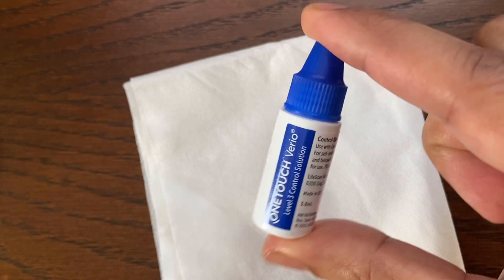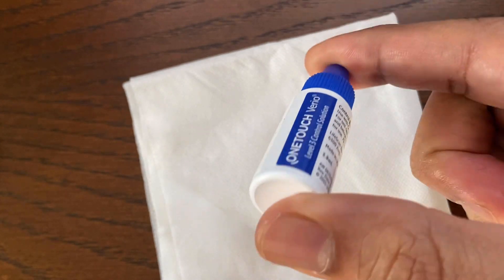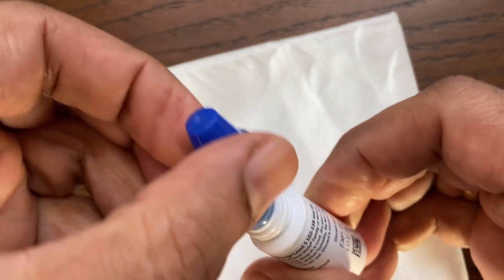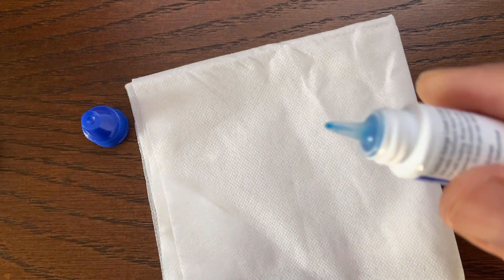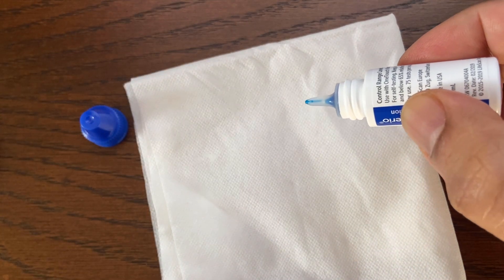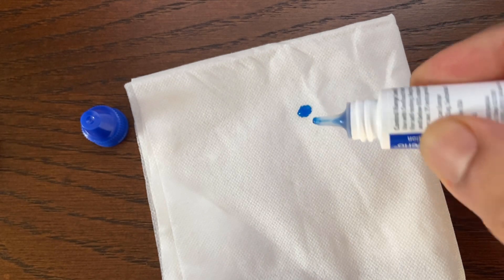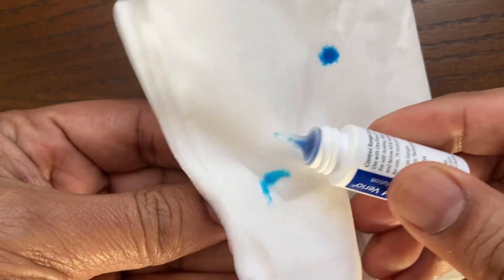Next, shake the control solution bottle gently. Also make sure to check the expiration date and instructions on the bottle to determine the discard date. Remove the cap and squeeze the bottle to discard the first one or two drops, then wipe the tip with a clean tissue or cloth.